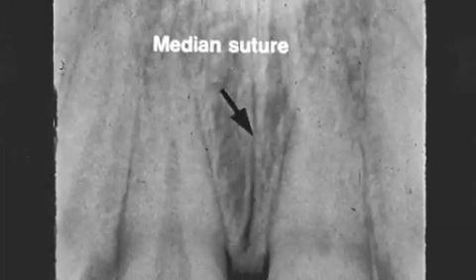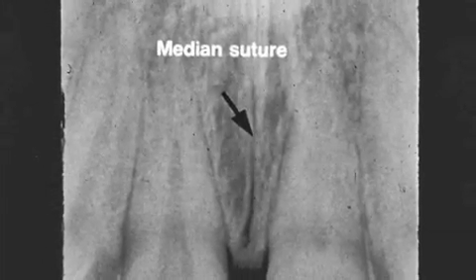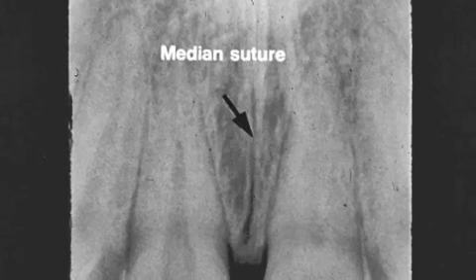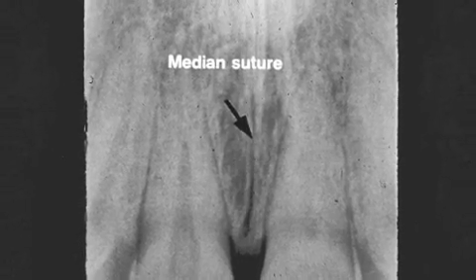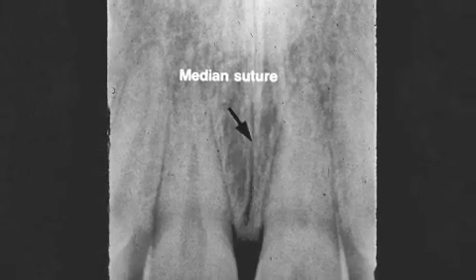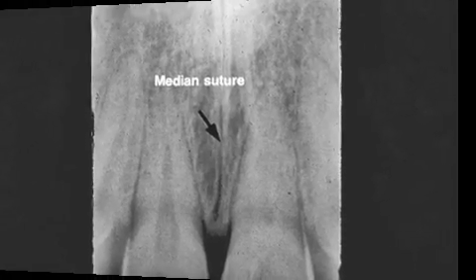The arrow points to the radiolucent line called the median suture. This is where the right and left sides of the maxilla join.